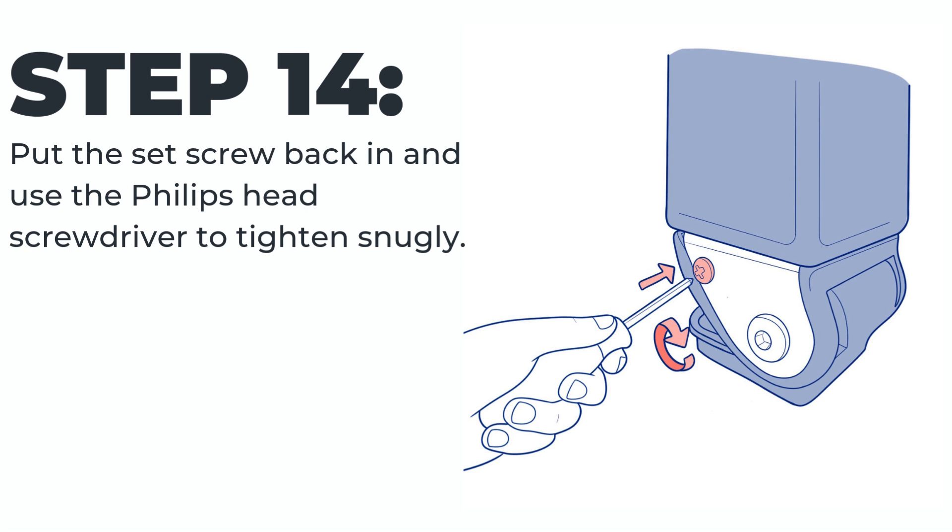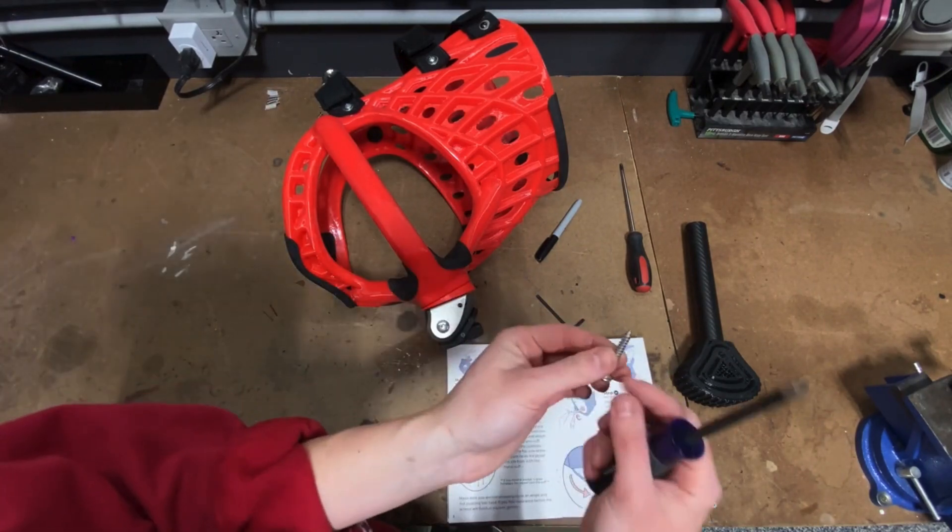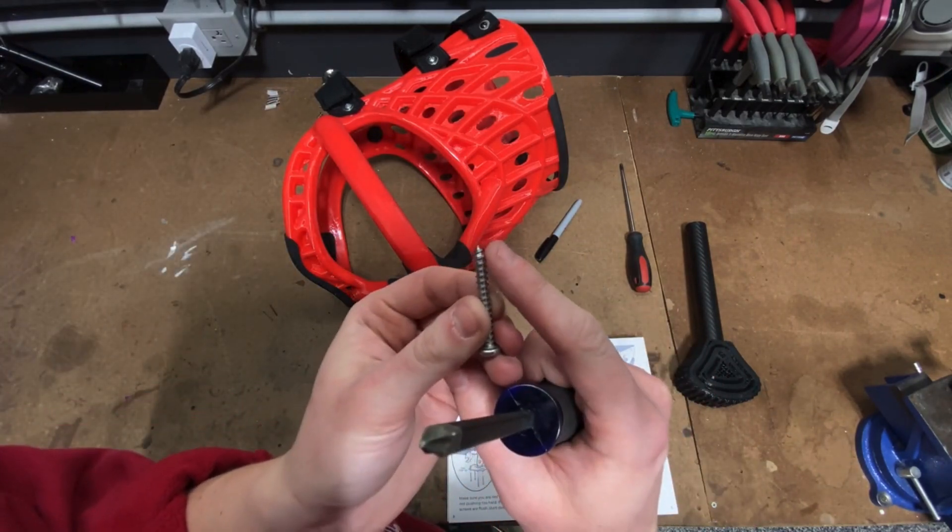Step fourteen: put the set screw back in and use the Phillips head screwdriver to tighten snugly. The set screw is the one with the pointed end, but don't worry — it is not able to come out the other side of the elbow joint.